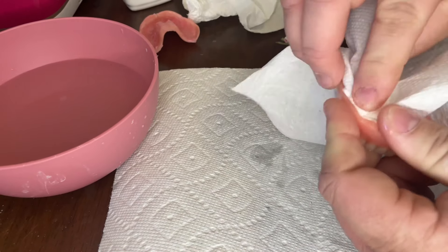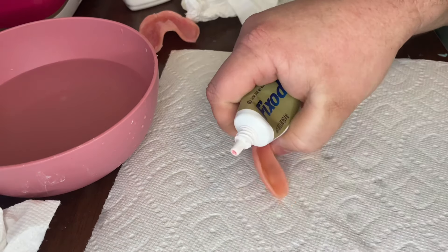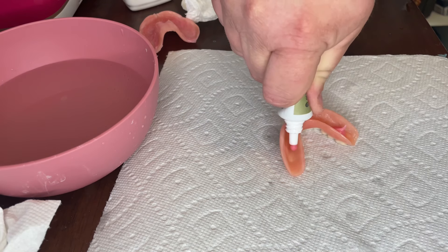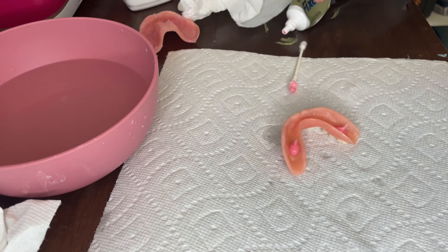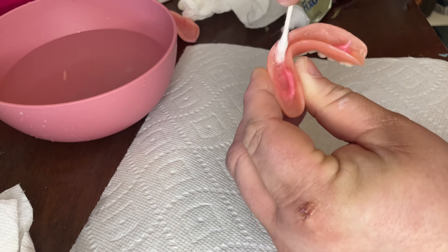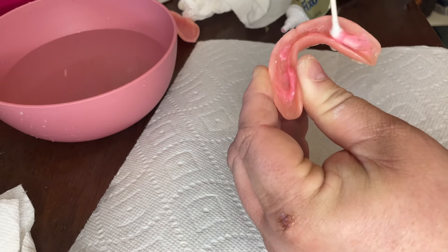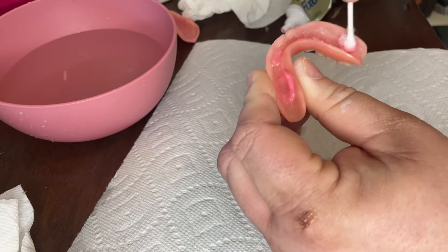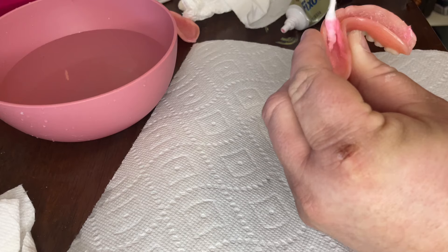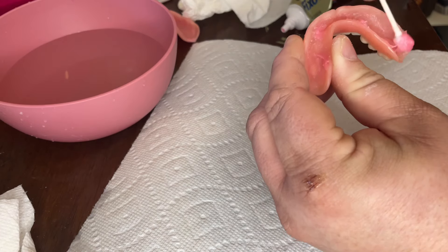With the lower denture, you do the same thing — clean, dry, and get it ready for the paste adhesive. My lower denture is pretty narrow in the front, so I only need two small drops of adhesive. It may vary depending on the size of your denture. Grab your q-tip and start spreading it out into a nice, even, thin layer. My front trough is pretty narrow, so it's kind of hard to get in there with a q-tip, but I do my best to spread it out evenly. I removed a big glob so it didn't ooze out, and added a little extra to the other side to fill in a spot that needed more adhesive.